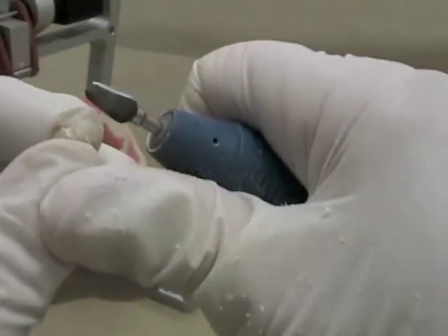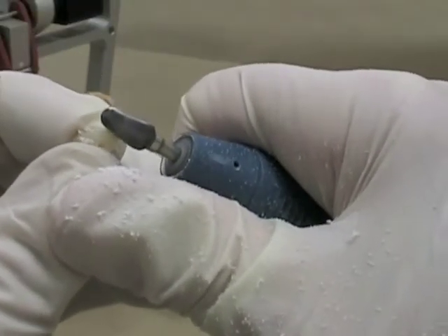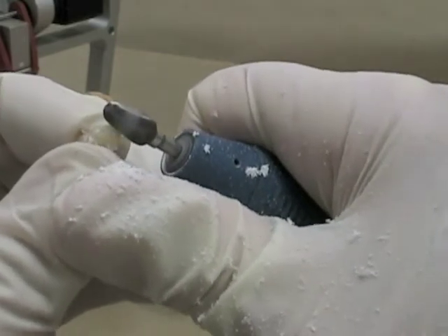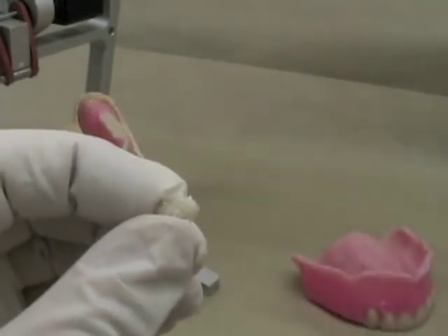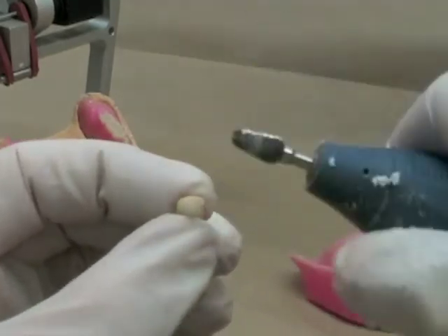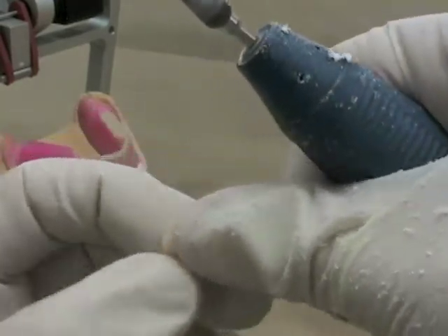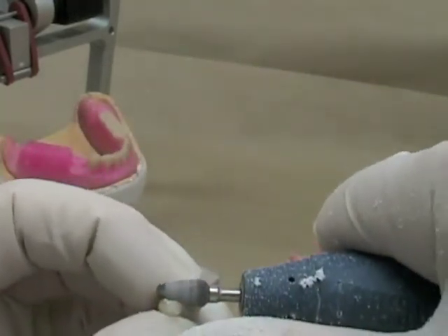As you're seeing here, when you're adjusting denture teeth, make sure to keep your gloved fingers away from the burr. I'm going to be moving around so I keep that nice roundness to the cervical portion of the tooth. I'm also going to thin it out a little bit from the lingual surface of the tooth so I can tuck that in a little bit closer to the record base.